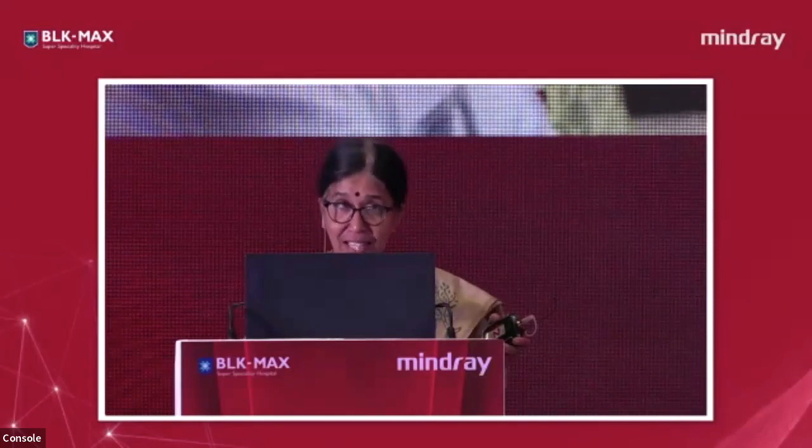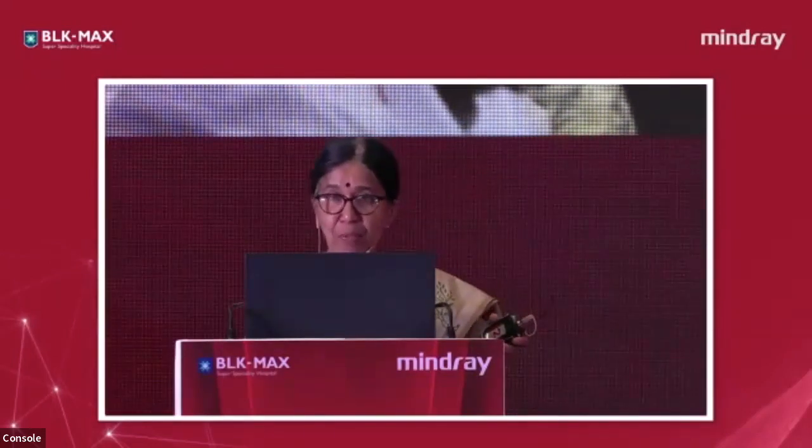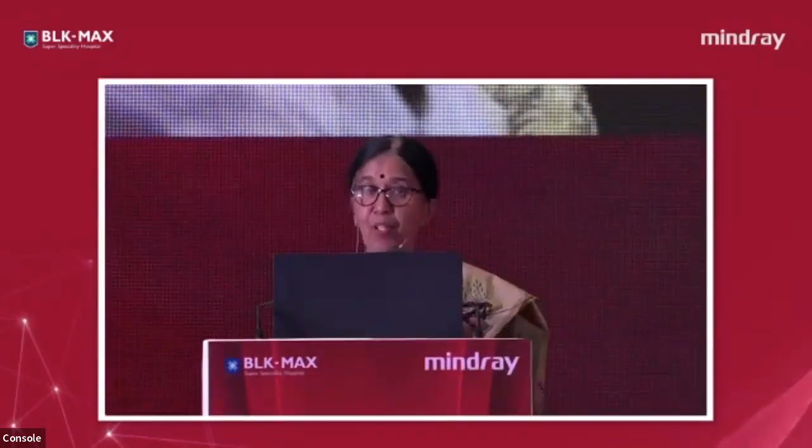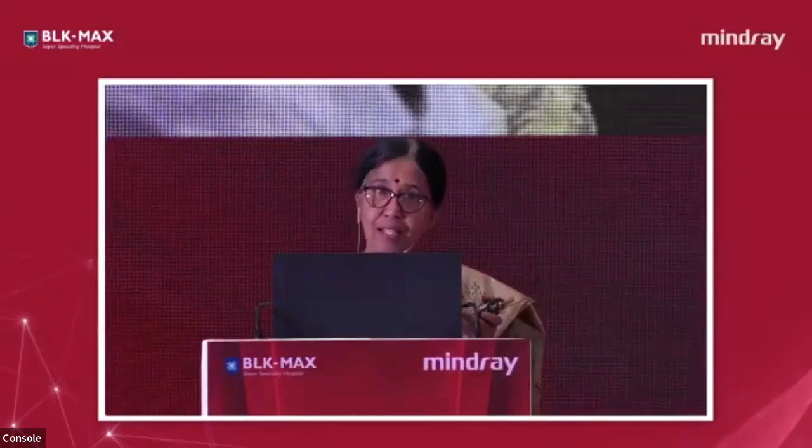Two questions. Yes. Ma'am, I think you have just hit the nail on the head. In fact, that's what my concluding session was. There is an urgent need, an absolute need, to harmonize the results generated, because there are analyzers, all of them good in their own way. Each of them has different methodologies of testing. However, in certain clinical situations, we can have discrepant results because of these variations, and there is a lack of reference methodologies available, contributing to the problem.